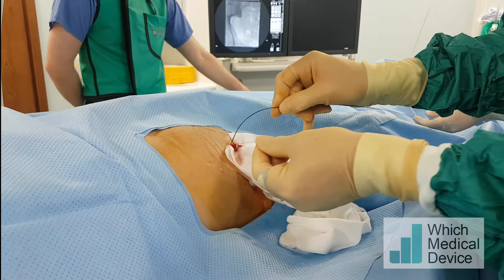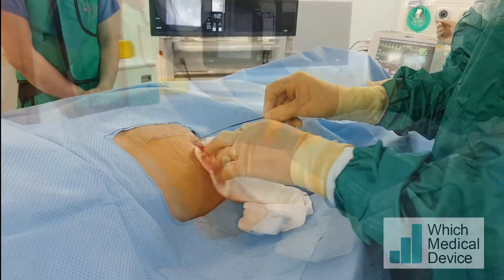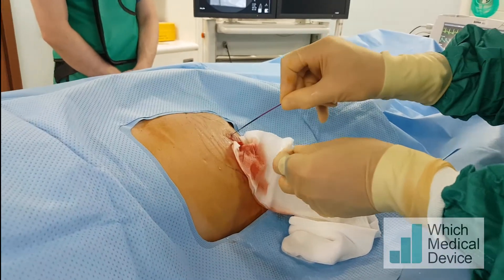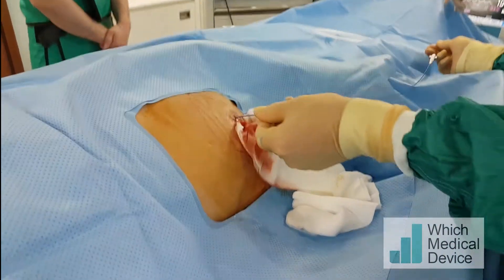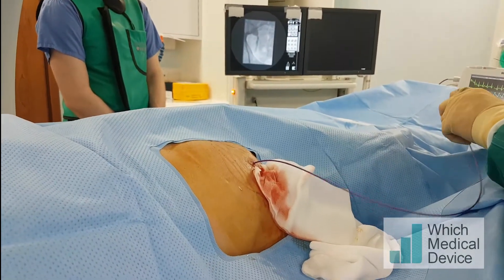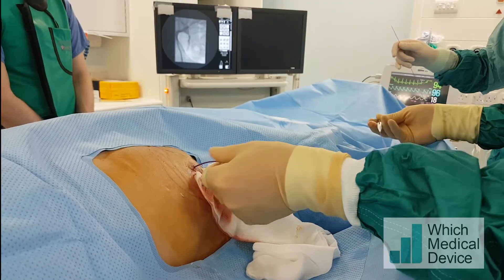You just have to make sure you remove the thread as well and don't leave that. I'm inserting a Merit Vantage 2 angle tip catheter over the Benson guide wire into the transplant. This will allow me to steer a guide wire down the ureter.